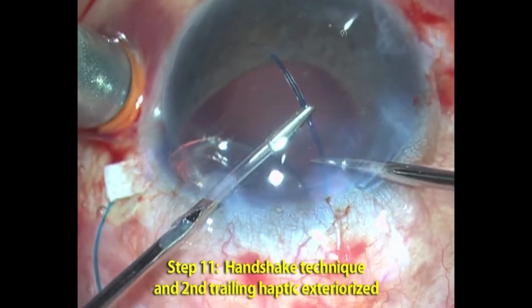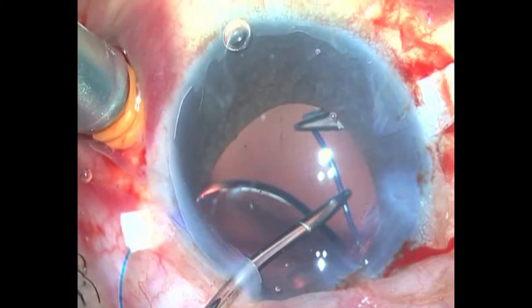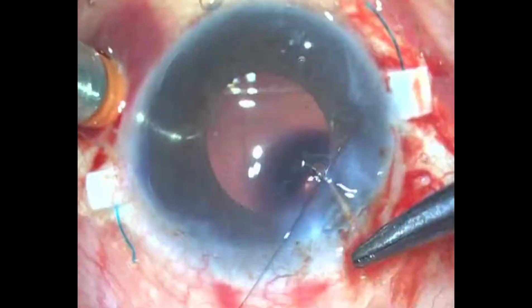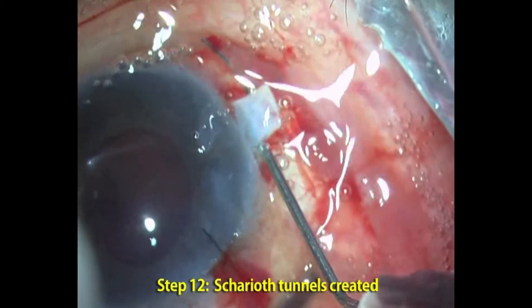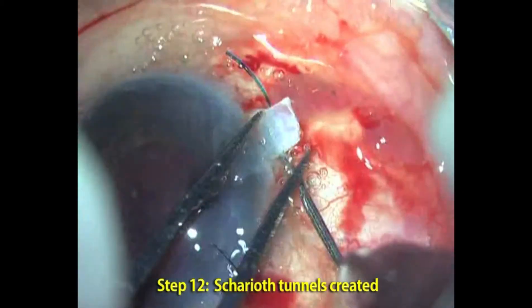With one haptic externalized on the sclera, the other haptic has to be externalized in the same way, but we use a technique called the handshake technique, in which the haptic is passed from one hand to another. Once both haptics are externalized, a 26 gauge needle is used to create intrascleral pockets.